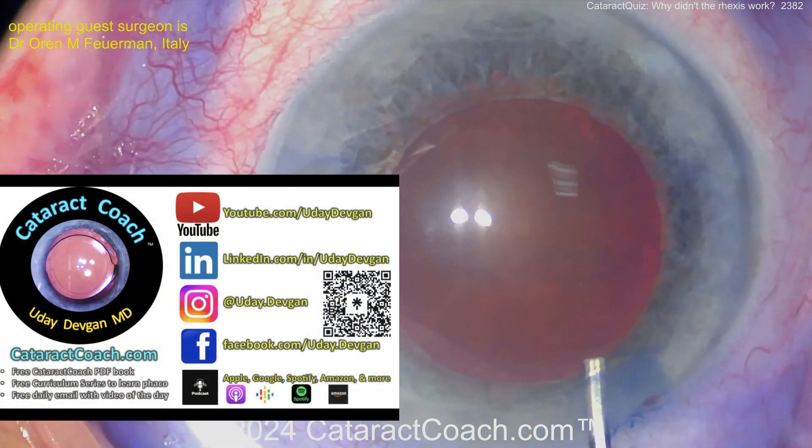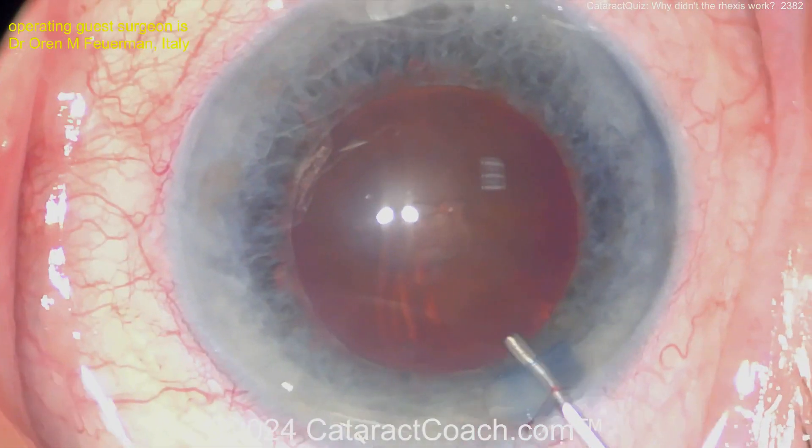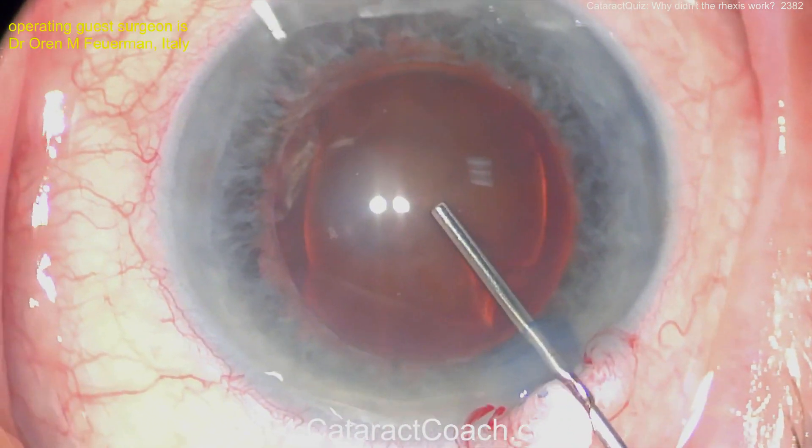Let me tell you about our podcast — the top podcast in all of ophthalmology. It will teach you to be more successful. Check it out. Now going back in here, viscoelastic going in and time for a capsulorrhexis — everything looks pretty routine.